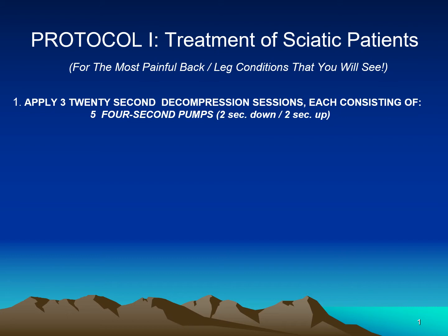Protocol 1 is the application of 3 20-second decompression sessions. And each session consists of 5 4-second pumps, 2 down and 2 up.